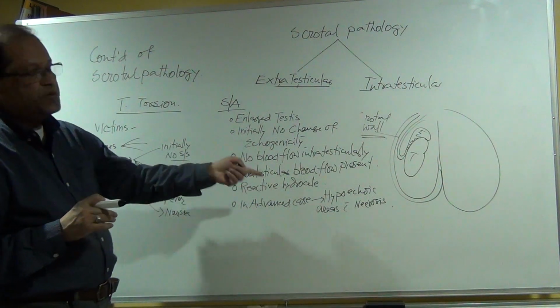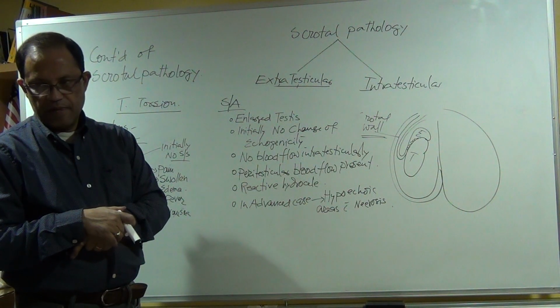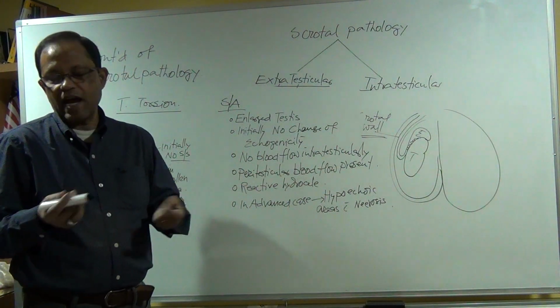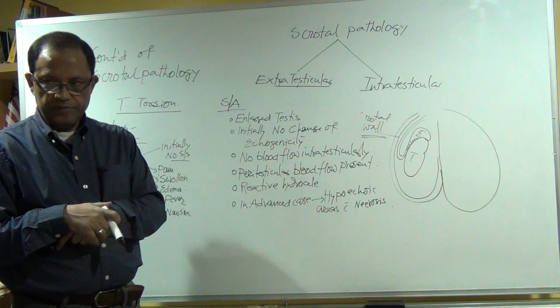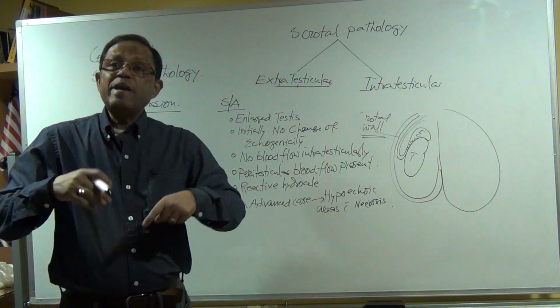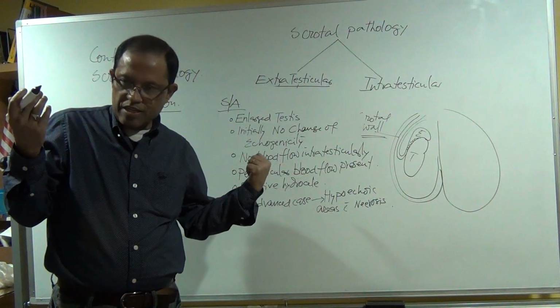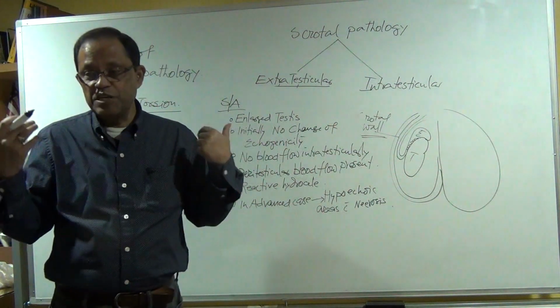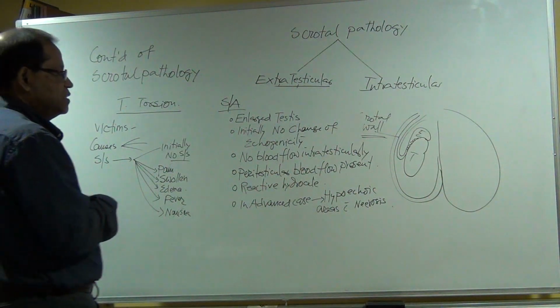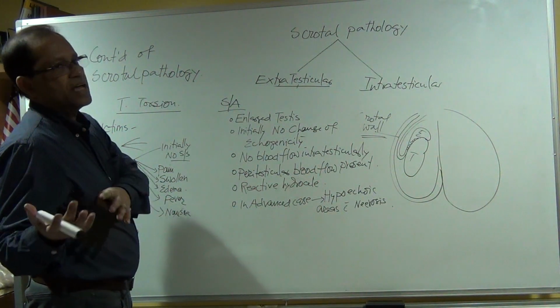How are you differentiating it from the orchitis? Blood flow. Testicular torsion, how are you differentiating it from the orchitis sonographically? The blood flow would be... Exactly. In orchitis, there will be increased intratesticular flow. Here, in torsion, there will be absent intratesticular flow. Absent. And then echo texture will be changing because it's dying. The tissues are dying.